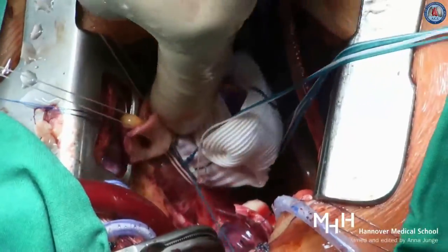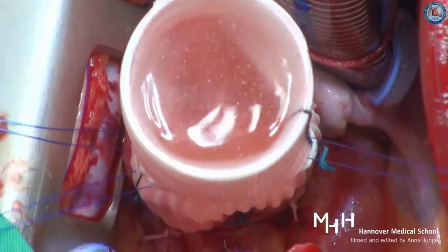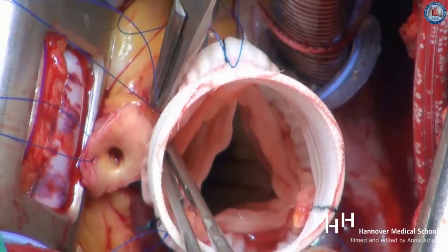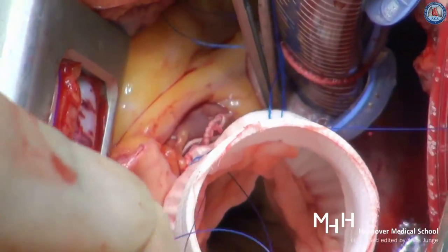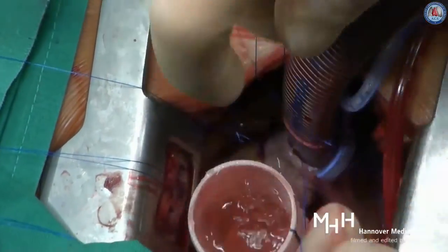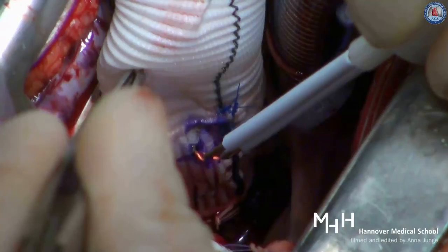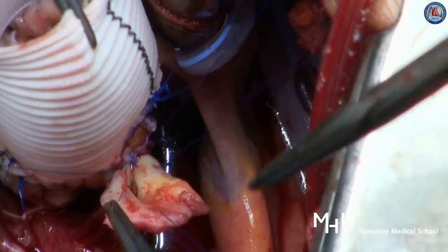A water test is performed to test the coaptation of the re-implanted aortic valve. Additional aortic valve leaflet repair is performed if necessary. The mobilized aortic root with remnants of aortic sinuses is sutured to the inside of the Dacron graft using 3-0 or 4-0 polypropylene sutures. This is the hemostatic suture line and as such must be absolutely blood-tight.